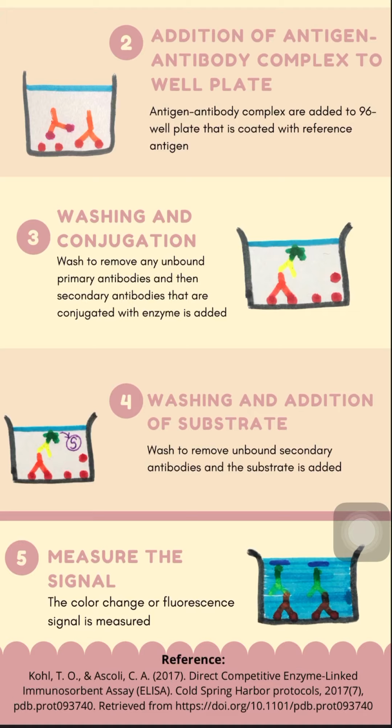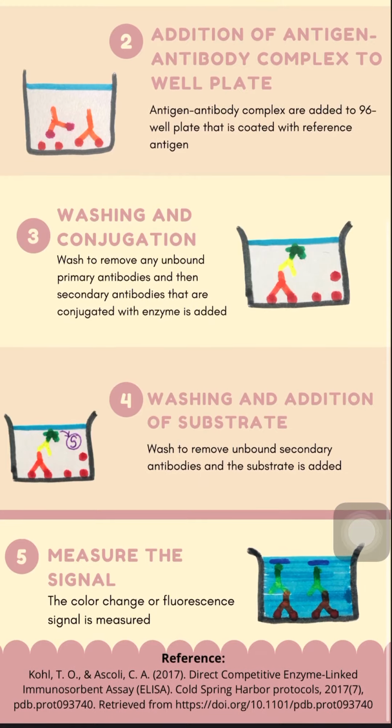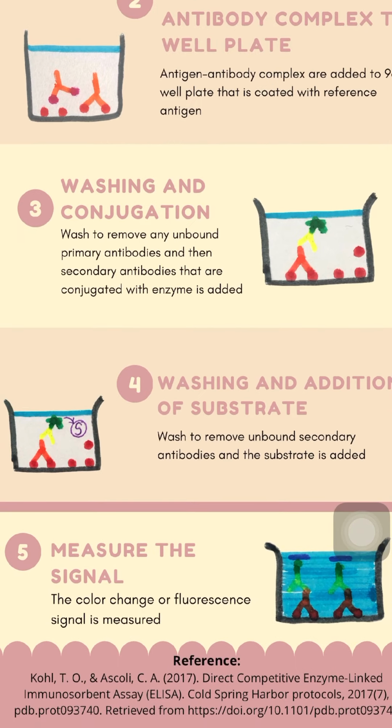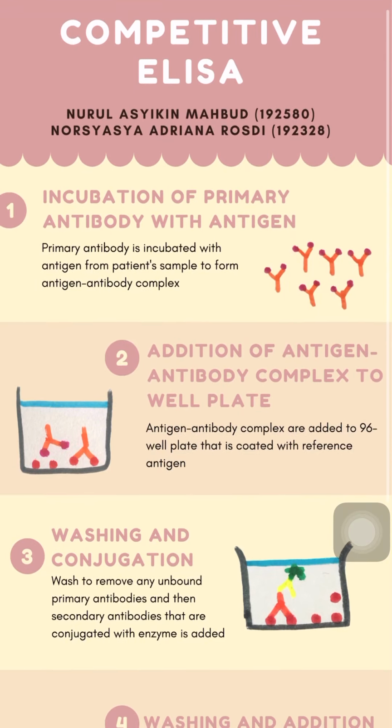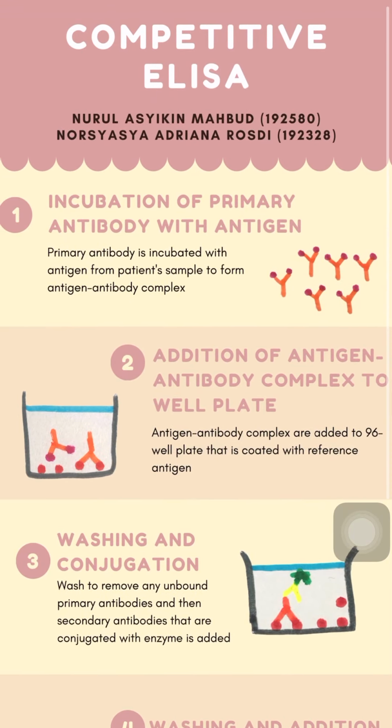If the signal is strong, then it indicates that the concentration of sample antigens is low because more reference antigens are bound to free primary antibodies. So this is our reference, and that is all for the principle of the competitive ELISA. Thank you.